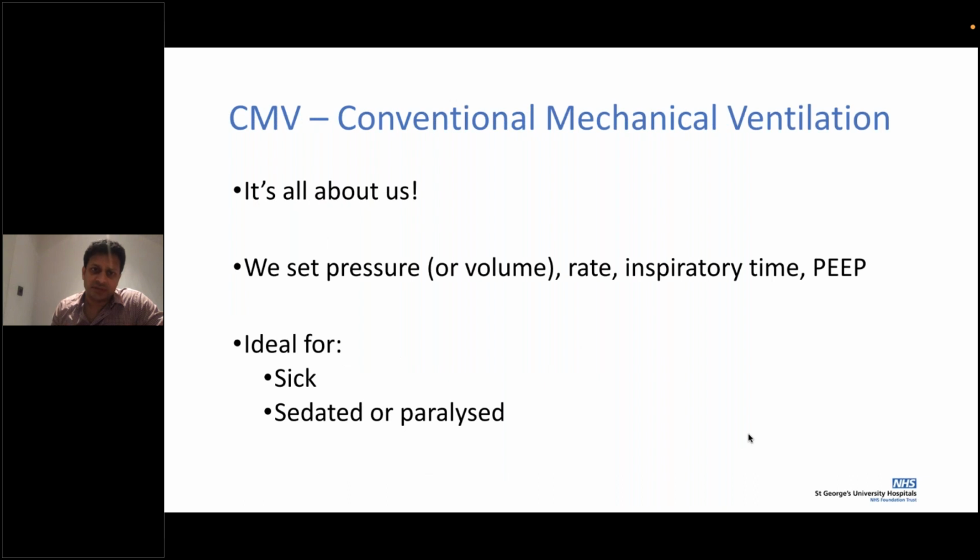What does CMV mean? So basically, as I said, it's a sick patient, a paralyzed patient, a sedated patient. In that case, you are basically having set pressures, rate, inspiratory time, and PEEP. And then once the baby is getting better, when there is more trigger involved, you support that trigger, you reduce your sedation, and get the baby to actually synchronize with your ventilator. So this is the ventilator taking complete control of the situation.